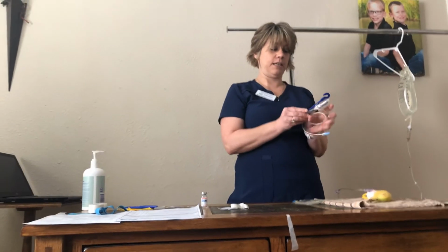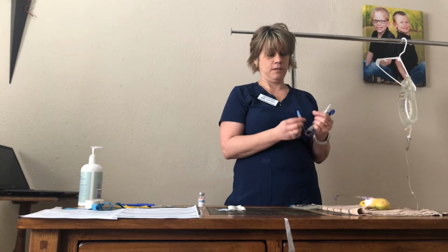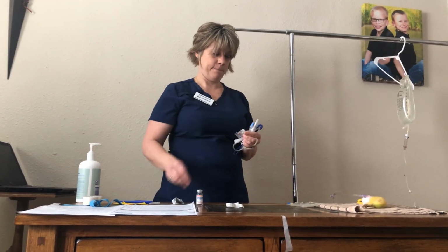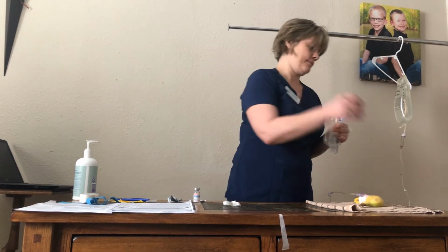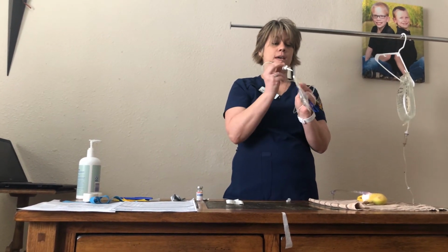Going to go ahead and get this clamp closed. I'm going to get another alcohol ready. Not going to touch the spike to anything but into the bag.